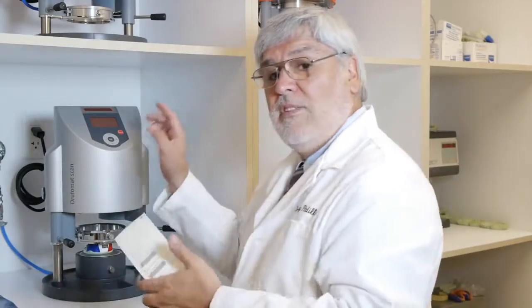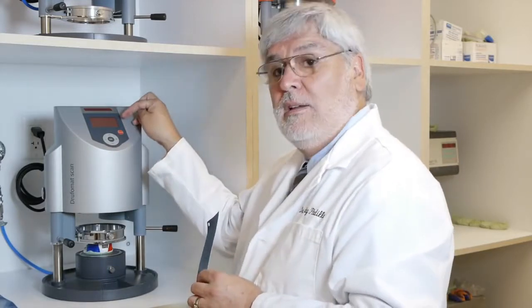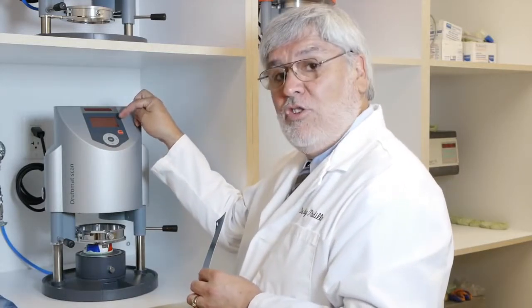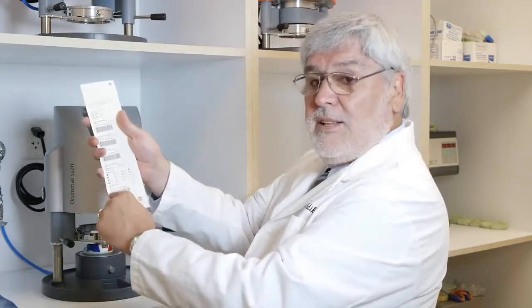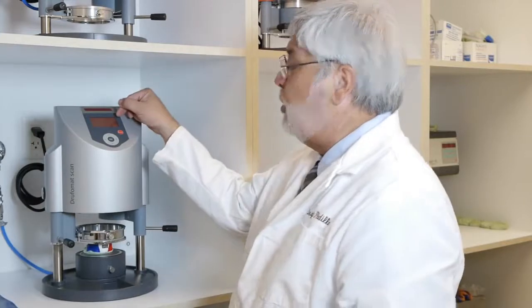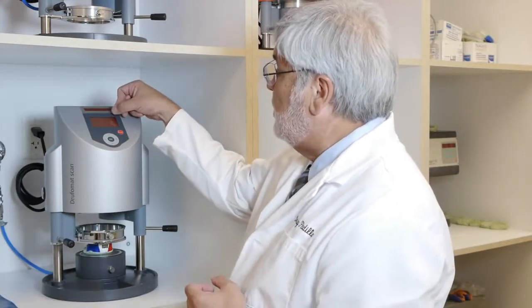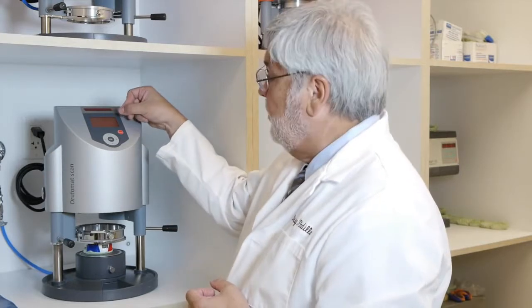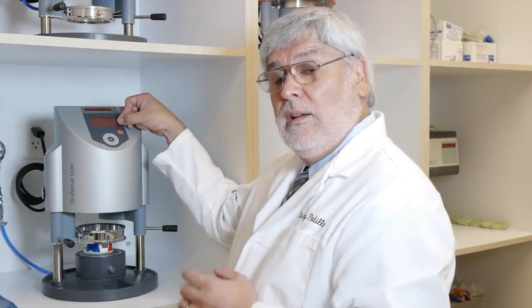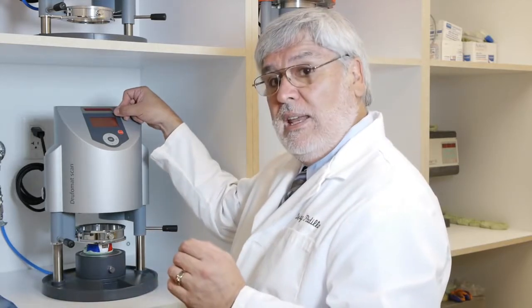Now there's two ways of getting the second layer scanned. One, you can pre-program it in the machine, or you can just scan second layer. Either way works. I have already pre-programmed my machine to the second layer, which is 3 minutes of heating and 8 minutes of cooling. The first layer was much less than that. It was only 2 minutes of heating.